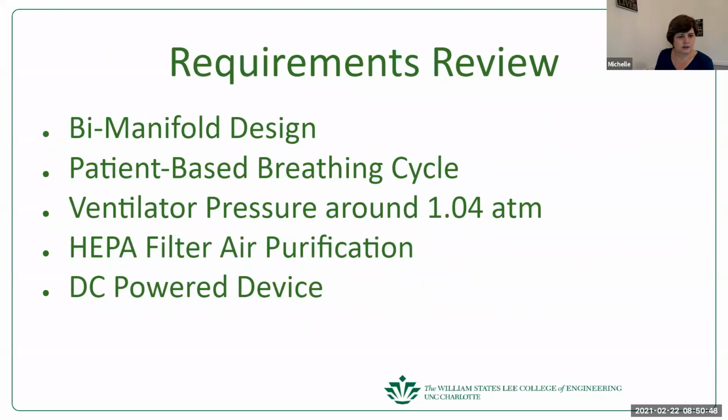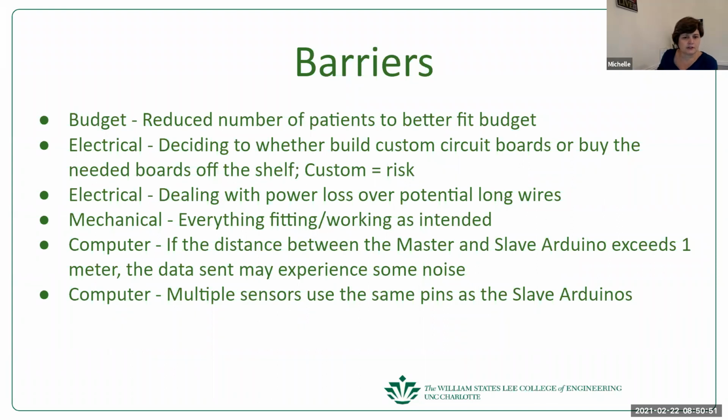Can I ask you a question? If you did do the wireless, does that solve the 1 meter problem? Not necessarily. Because since the other sensors are also using I2C, we wouldn't be able to use the wireless communication with those, because that would only work with the Arduino. The amount of noise experienced from 1 meter, or beyond 1 meter, isn't much. It doesn't really get to being a problem until you reach 9 meters, which we are well within the range.